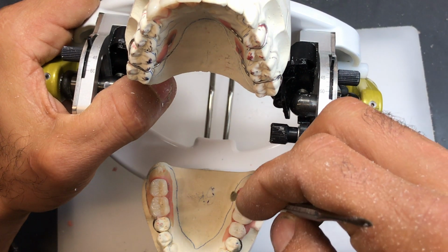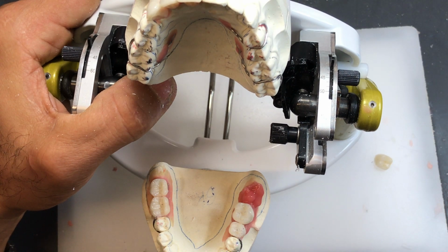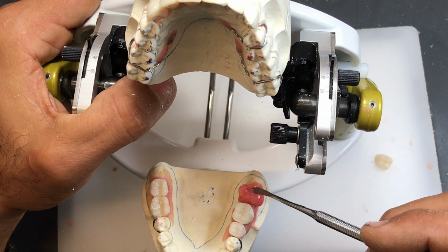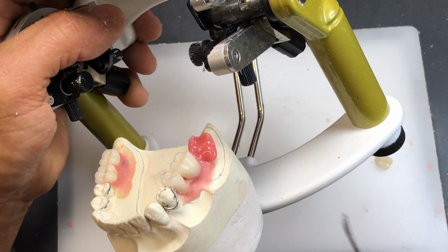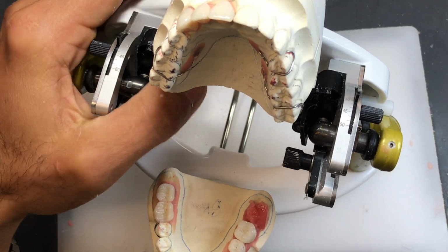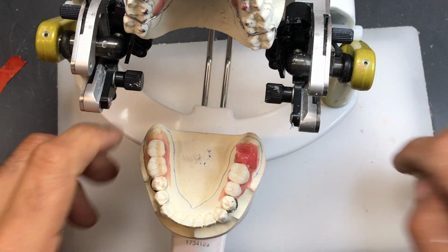Now these are simulation models, so if you end up going past 2/3 of the retromolar pad, don't worry about it when you're doing your project. But ideally on real cases, providing that the opposing has not super erupted, the height of the tooth will end up being 2/3 of the retromolar pad. Okay.